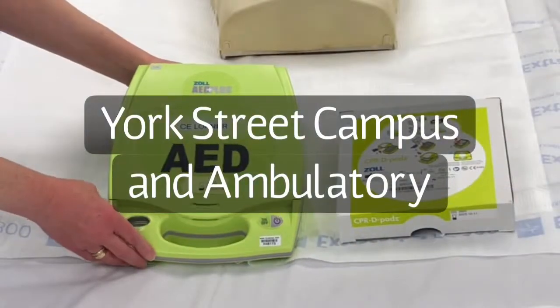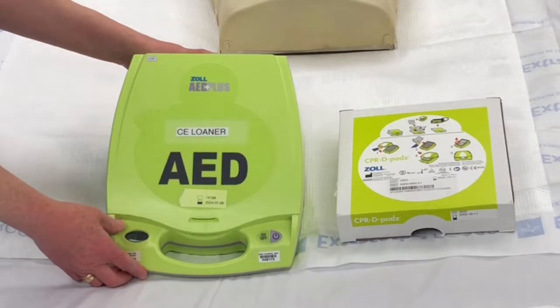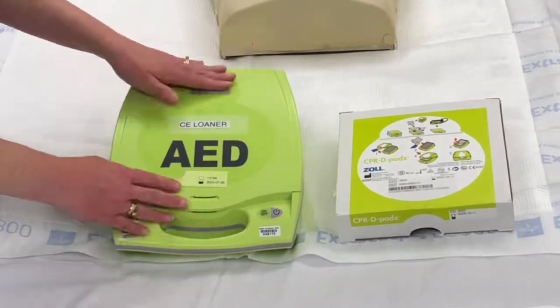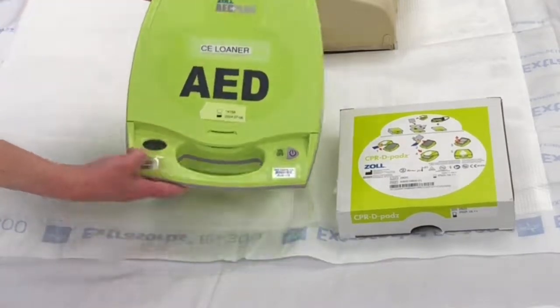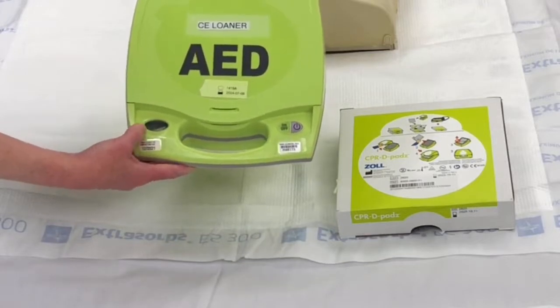At the York Street campus and some of our ambulatory sites, we have the Zoll AED Plus, and that's in a green clamshell. There is a pad loaded into the device, or should be loaded into the device. We know it's ready when we have a green check in the window here.